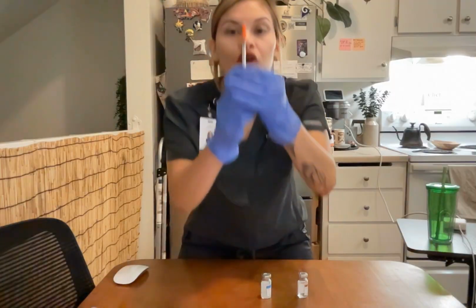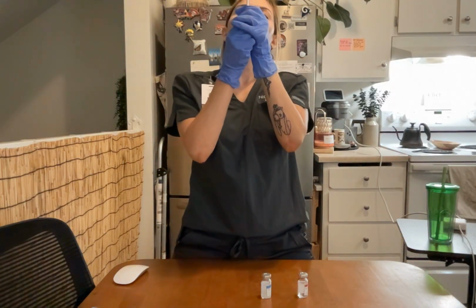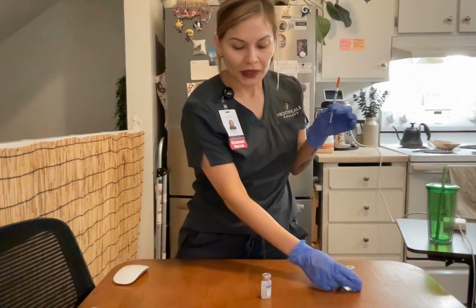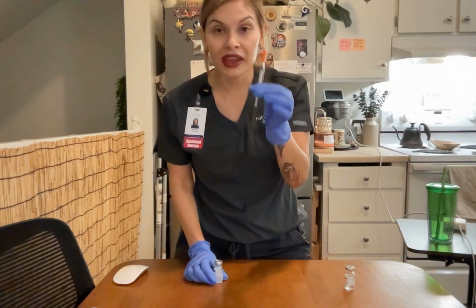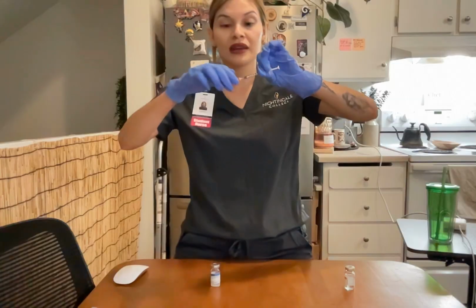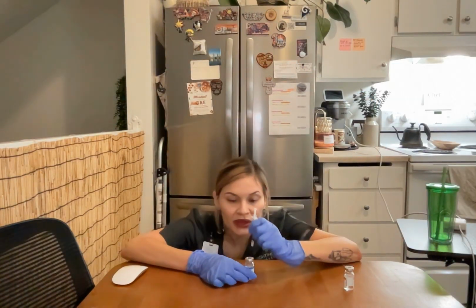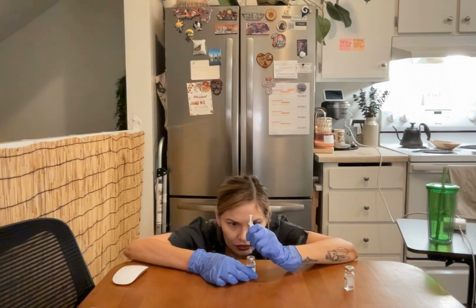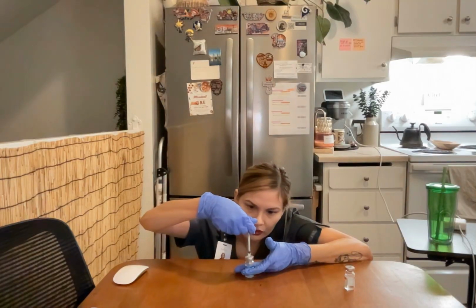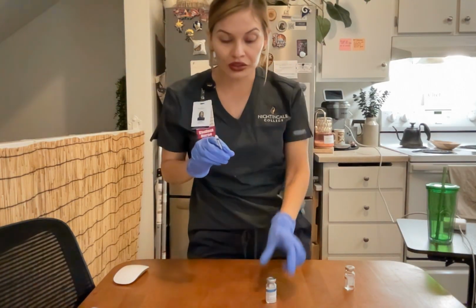Now, with the cap still on, I'm going to fill the syringe with air to the prescribed order of NPH insulin, which is 8 units. I'm going to remove the cap and inject the air into the NPH insulin vial. While injecting the air, I make sure that the needle doesn't get in contact with the NPH medication.